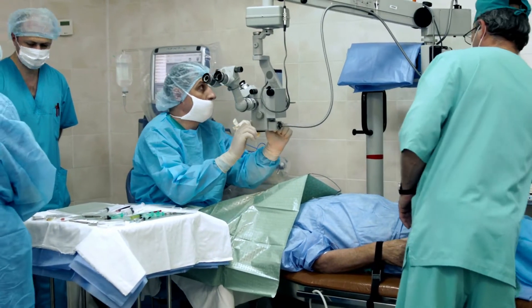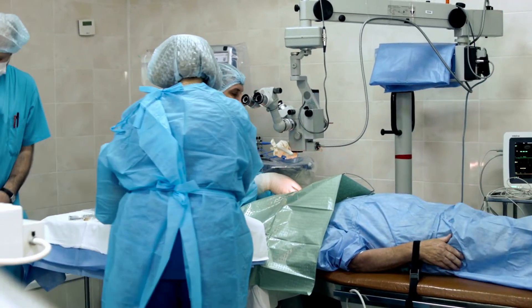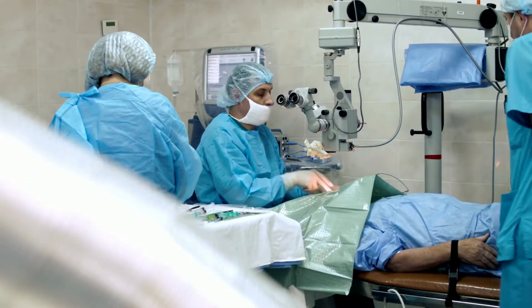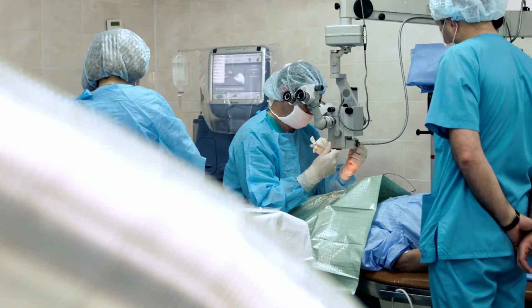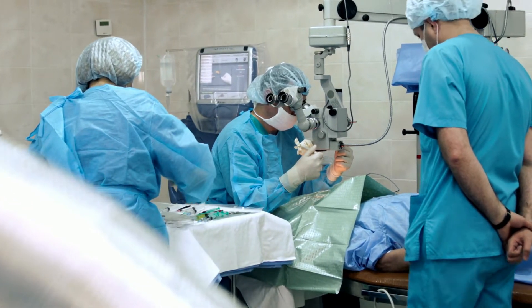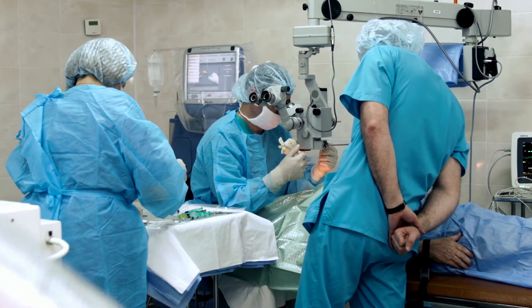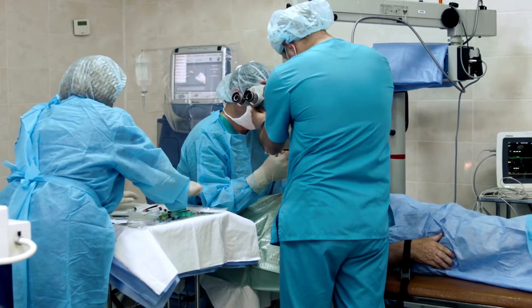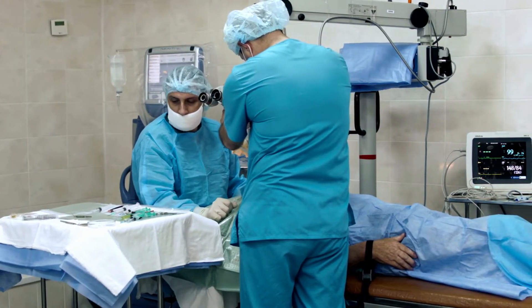Phacoemulsification cataract surgery is a common surgical technique. Unfortunately, many patients experience complications, and problems while performing continuous curvilinear capsulorrhexis, or CCC, is often the reason for poor surgical outcomes of cataract surgery.